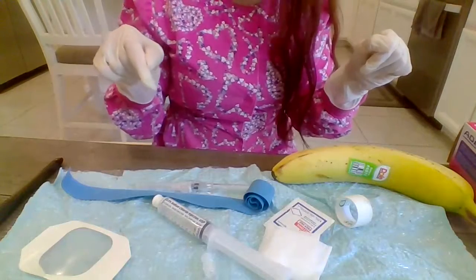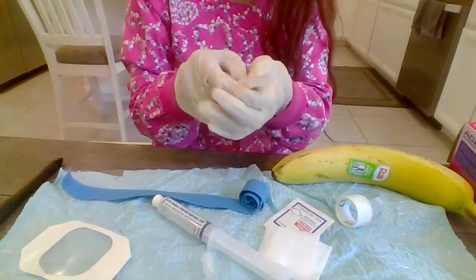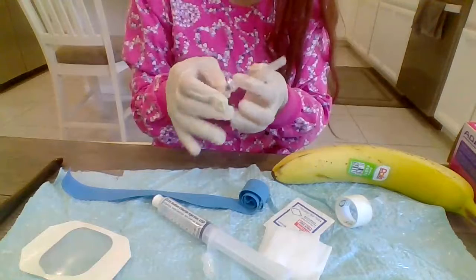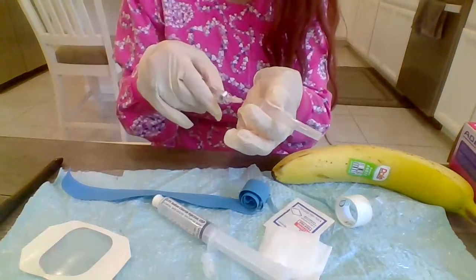I'm going to test the catheter, make sure it works. I'm just going to slide the catheter a little bit and see if it still goes in and out. It's very smooth, that's very good.